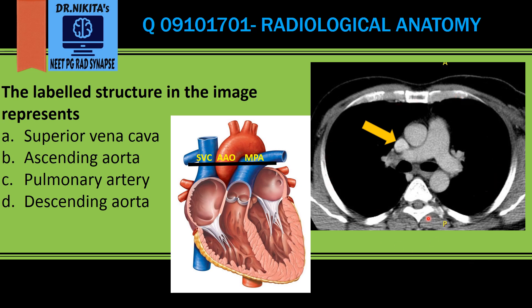First of all, this is a CT chest because the bones are white, and this is a contrast-enhanced CT because the vessels are white. If we take a section of the CT from right to left, we would see SVC, ascending aorta, and pulmonary artery — and that is exactly what the CT chest is showing.